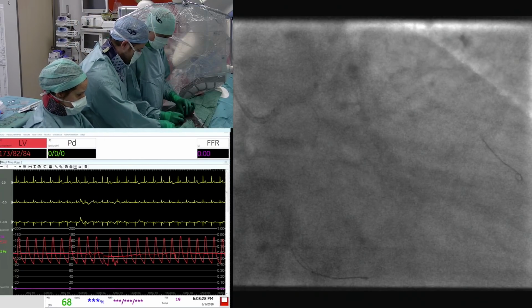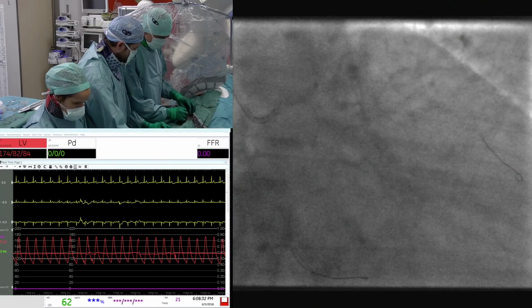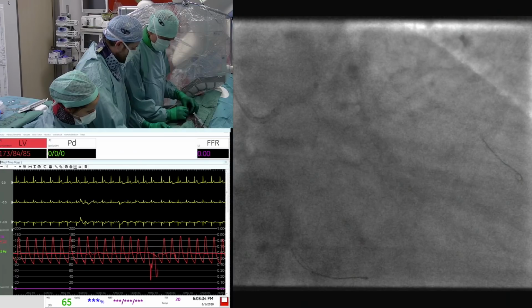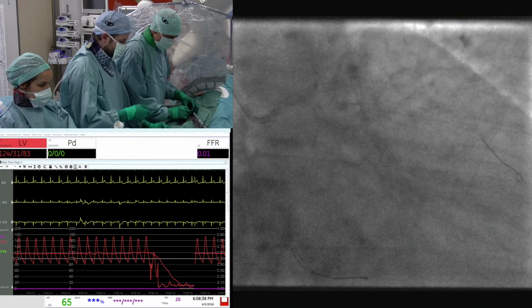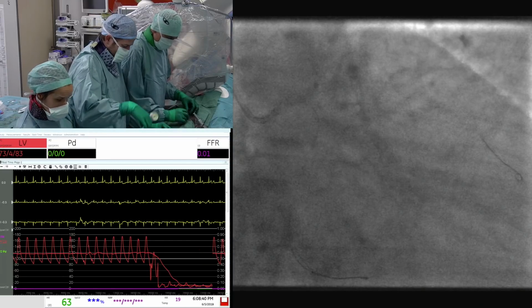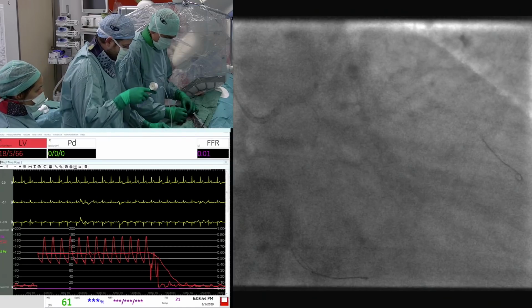Do you think it makes sense to remove now the side branch wire if we think that we don't want to treat it? No, because this balloon has completely lost its profile, and I'm not sure it will be that easy, I mean before inflating. So when you are already in place, but before inflating, because even pulling out the jailed wire can stretch the strut somewhat.